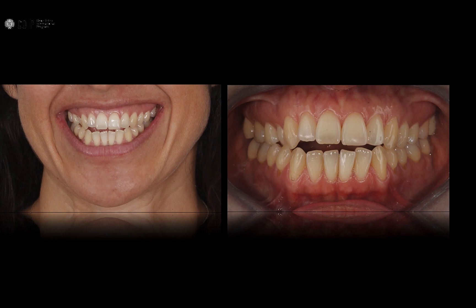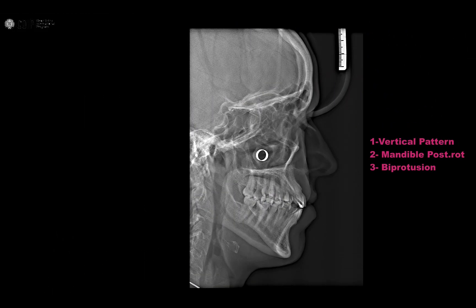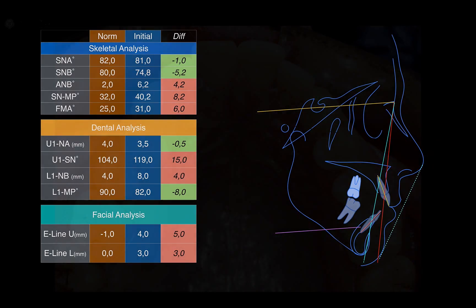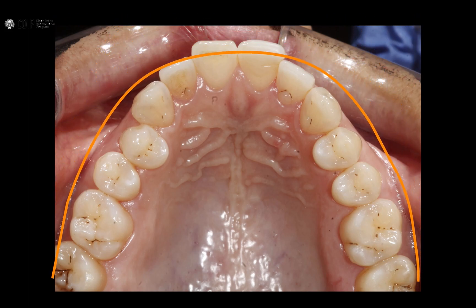This is the situation related to the gummy smile that she was complaining about a lot. As you can see here, we can see the arches. It's a really narrow upper arch, and that's why we have some protrusion of the upper incisors. Also, look at the crowding in the upper. We have the diagnosis to plan the case. I can see in this patient that she has a vertical pattern with the mandible posteriorly rotated, and because we have a narrow arch, the upper and lower incisors are bimaxillary protruded.